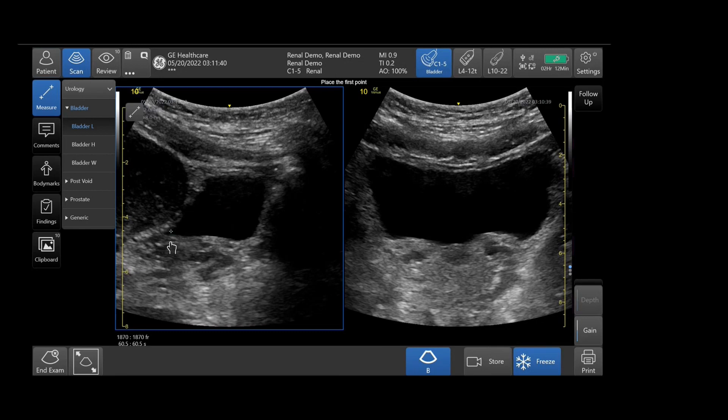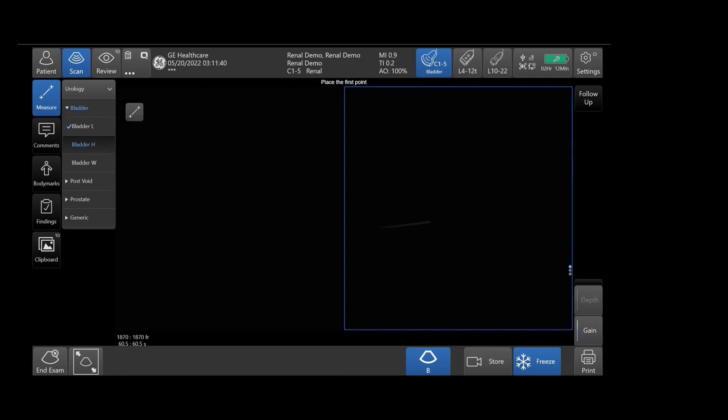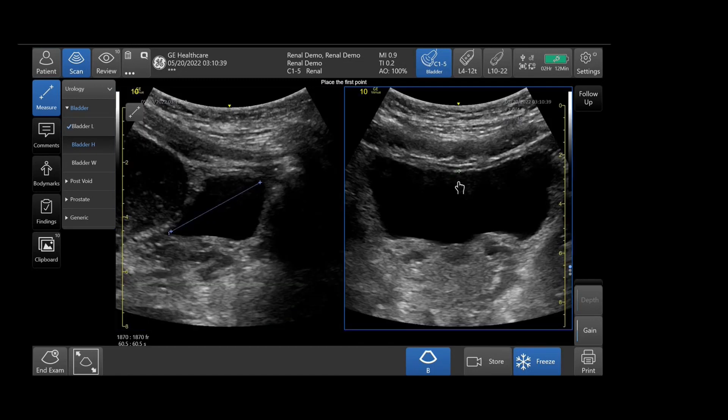Simply tap on the open hand — it will become a fist — and you can drag the caliper to the desired locations.